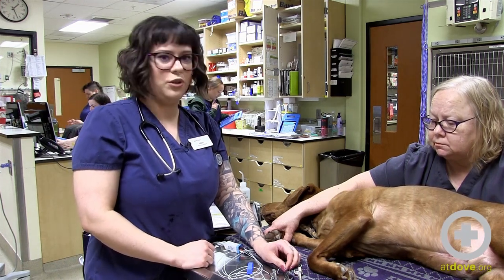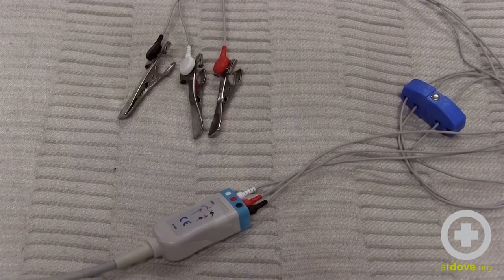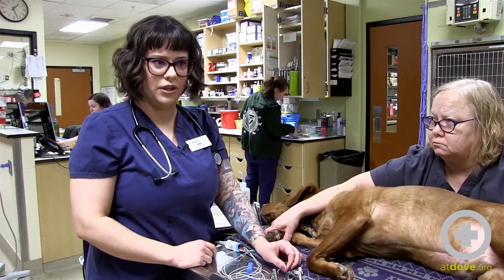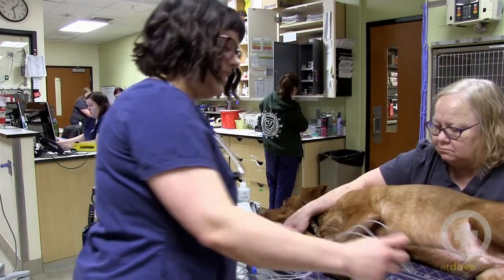The colors are basically the manufacturer's way of guiding where each lead should go on the animal. Some have green, some are white, red, and green, and then you have your four-lead systems which can be red, yellow, green, and black. So there's a bunch of colors and basically they're just the manufacturer telling you where to place each lead. Our system has the white on the right front limb, black on the left front limb, and red on the left hind limb. So I'll go ahead and place those now.